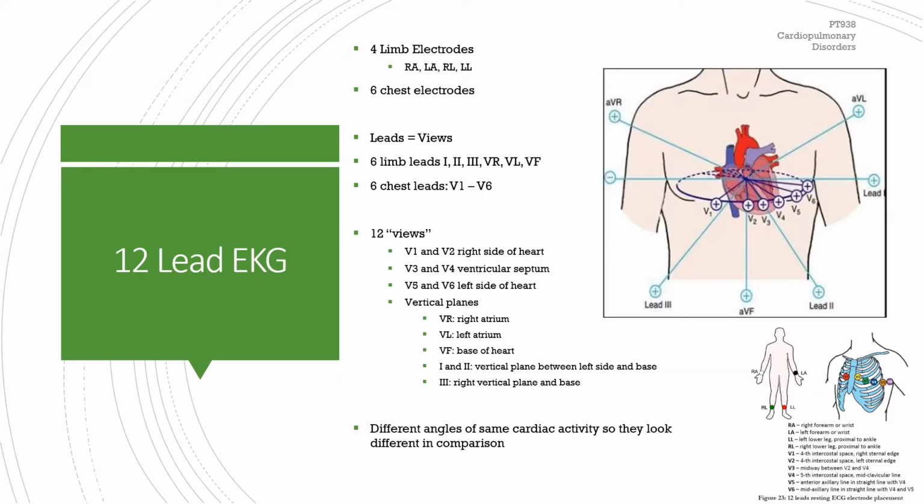All right, so all this time we've been talking about simple EKG rhythm strips like the telemetry encounters that you've had when you are in acute care. I've alluded to 12 leads a couple of times when we discussed ST elevation and depression, but you don't see that on the strips that we discussed because that's only up to 5 leads or 5 views. And usually you only get to see one of those tracking at a time. So we're going to talk 12 lead for a bit, but just the basics. It does go to physics, some of this, so you have to dust off some cobwebs.